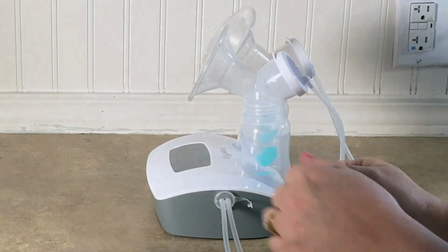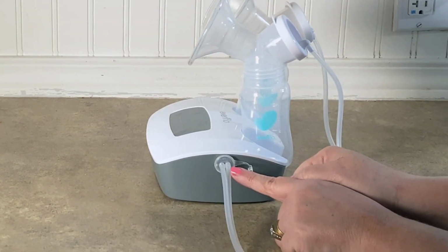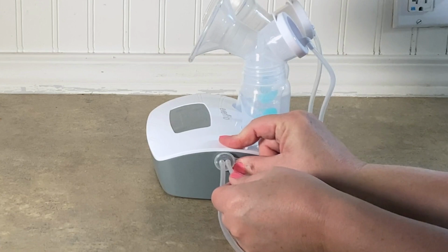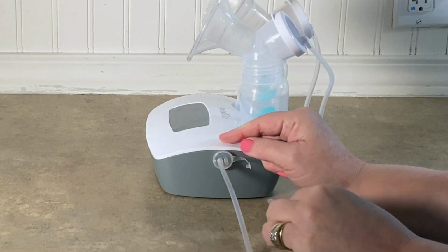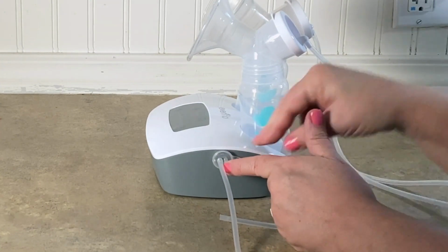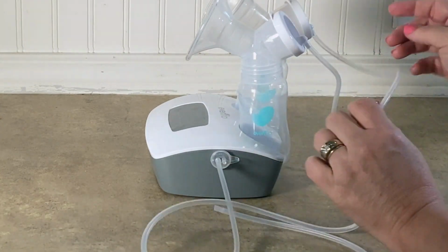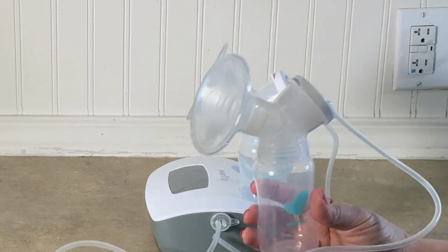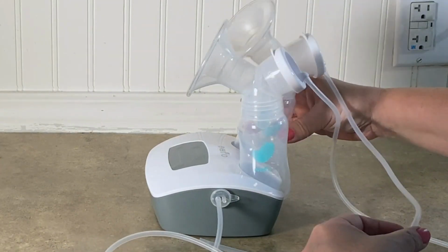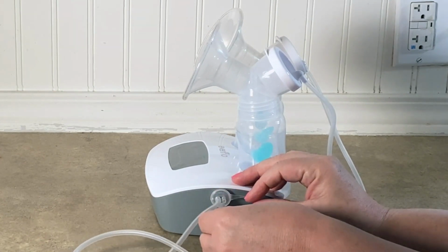Let me show you what to do if you want to do single pumping. We're going to start over here at the tubing adapter. We're going to remove the tube that's closest to this little cap. To remove a tube, simply grasp it with your fingers and pull it firmly until it pops off. Okay, now grab this little cap and you want to plug that hole. Perfect. All right, now we're going to follow the tube that's still attached to the pump and see which side we can pump with. Okay, so this is the one that we would single pump with the way our tubing's set up. If you want to double pump again, all you have to do is unplug this little cap, plug the tubing back in, and you're ready to go.